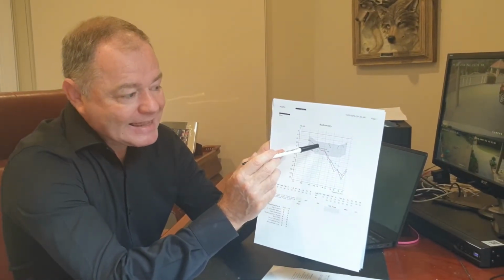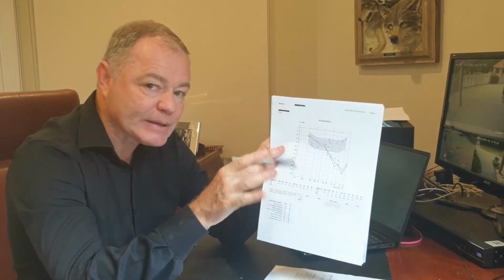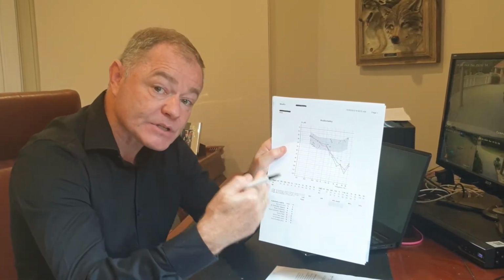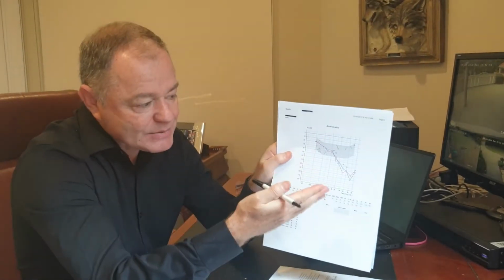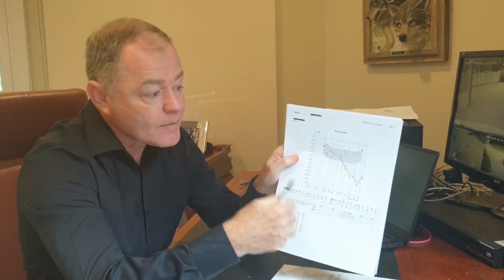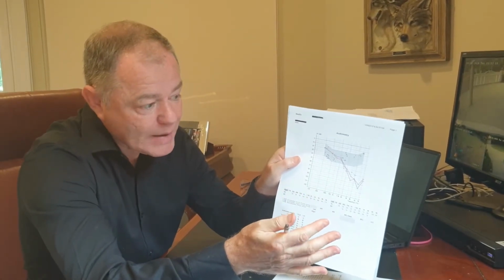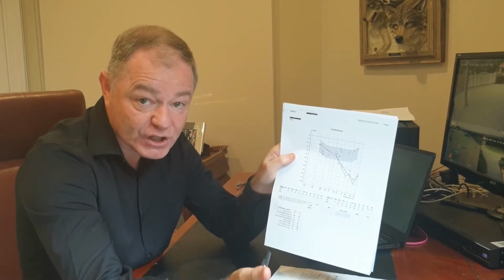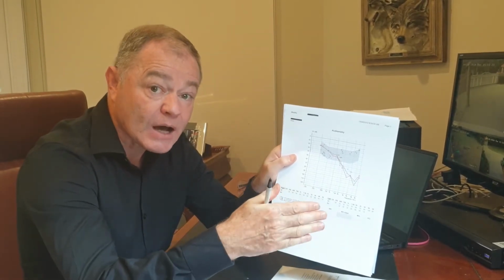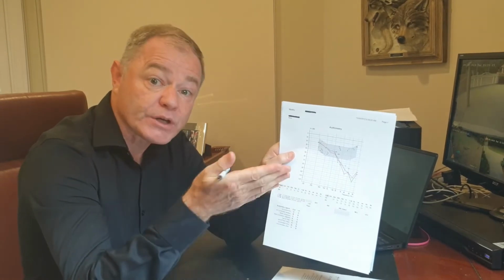So these types of losses, however, can be a little tricky in the sense that sometimes the client has a lack of awareness. What these types of people will normally say is, well, I can hear okay. Just occasionally I might misunderstand if somebody's mumbling or they're not speaking quite loudly enough. But other than that, really, my hearing's not too bad. Now, what tends to happen is that people get conditioned to their hearing loss. It's a slow process. You gradually lose it, so you're not all that conscious of just how much hearing you've lost. Not until we correct it.